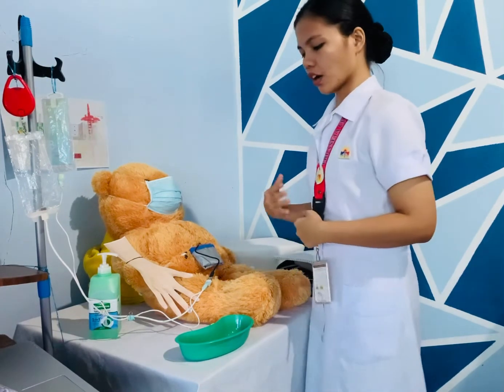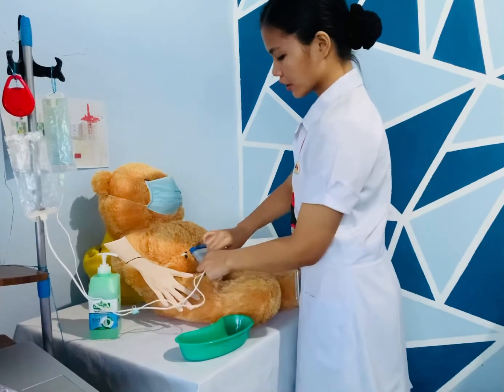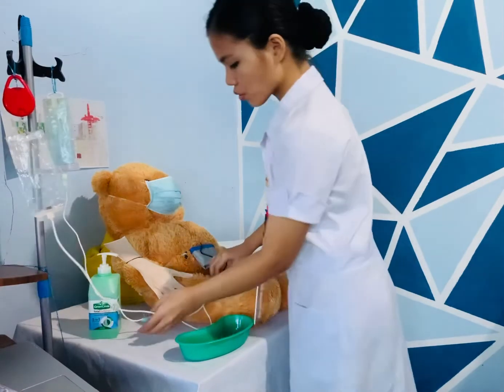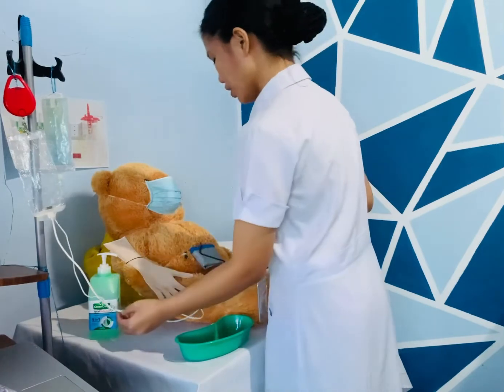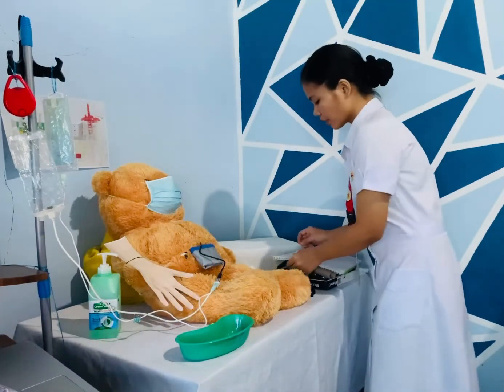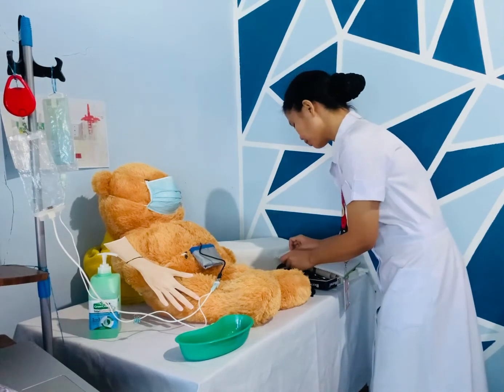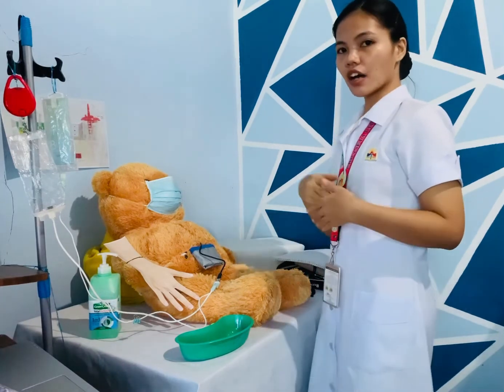So once the filling is completed, close the twist clamp on the transfer set. Then close the blue clamp on the fill line. Okay. Then record the volume in and time taken to fill in the record book. Okay, next is the disconnection.